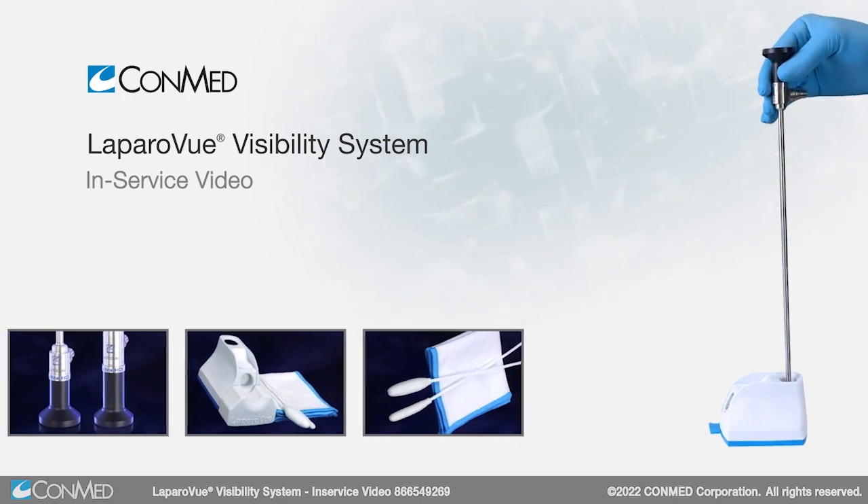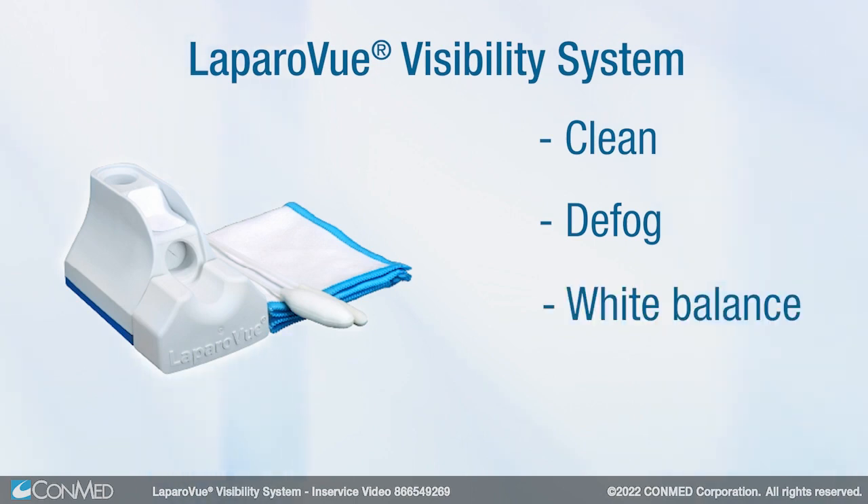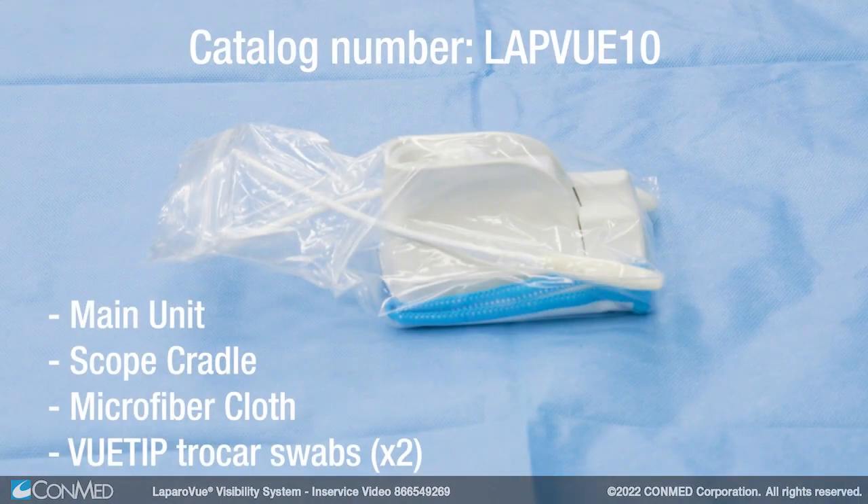The Laparovue Visibility System is a simple and efficient unit that cleans, defogs, white balances, and warms scopes for laparoscopic and robotic cases. The main unit, scope cradle, microfiber cloth, and two view-tip trocar swabs come in a sterile peel pack.